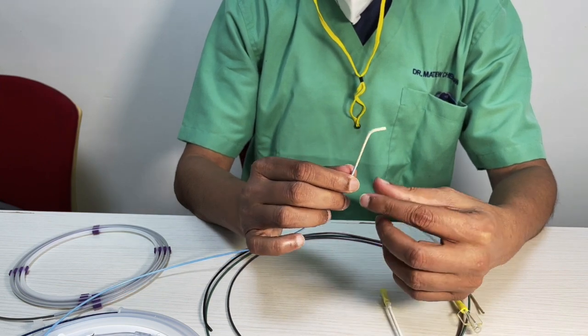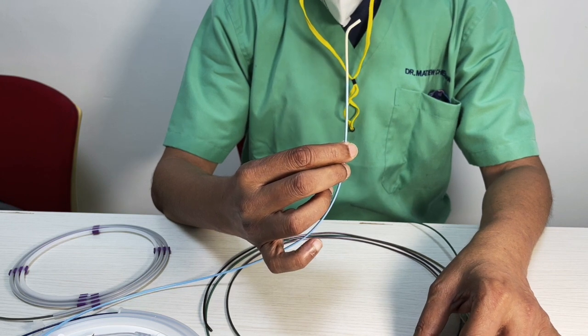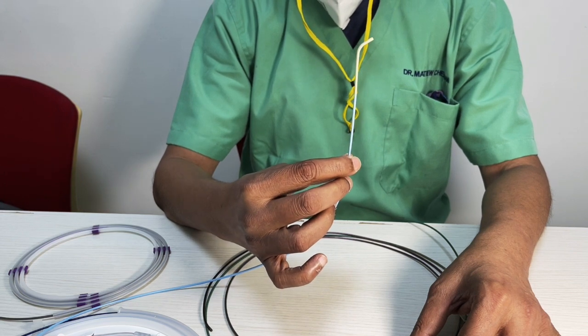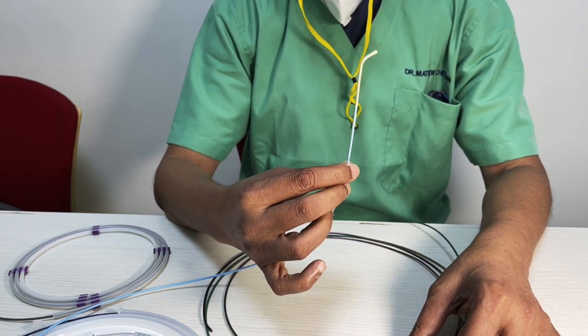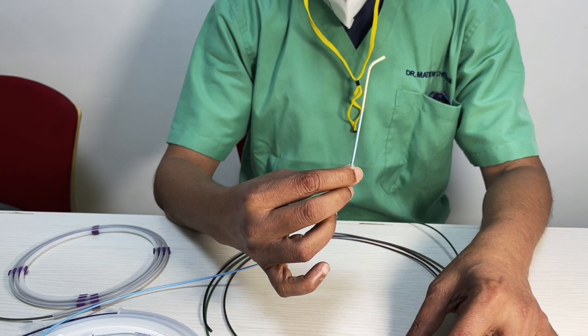When a microcatheter goes inside a tube like this, the microcatheter remains more or less straight. So the forward thrust that we give onto the microcatheter is transmitted in line with the microcatheter, and so the tip will move forward without much of a problem.